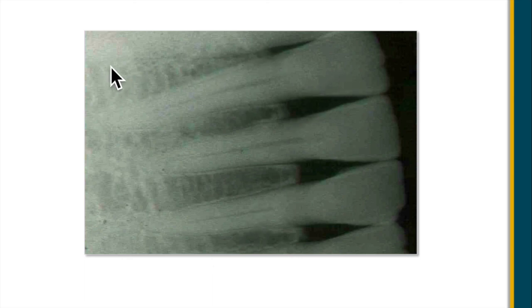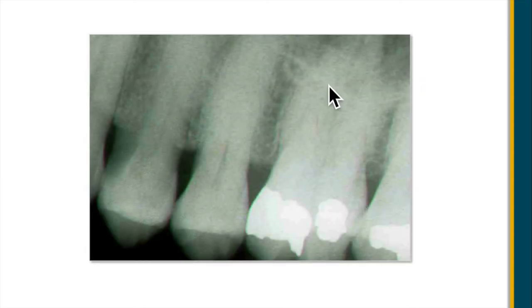So I'm going to assume this is 27, 26, 25, 24. Got a little chip missing out of it there. Again, sinuses up in here, very subtle, but things you'll start to notice. But that's the floor of the sinus, so this would be tooth number 14.